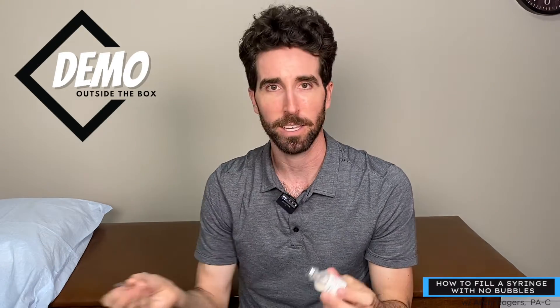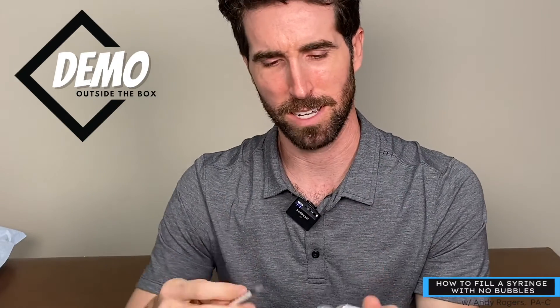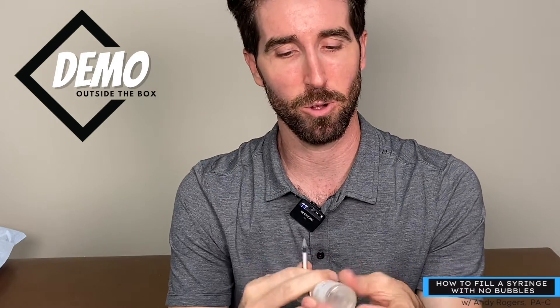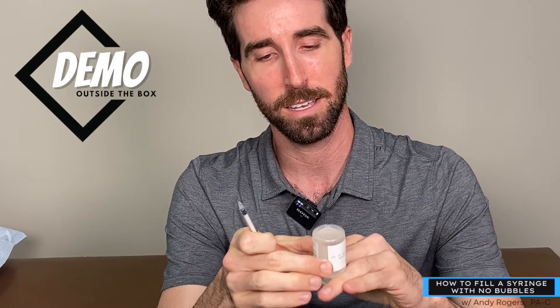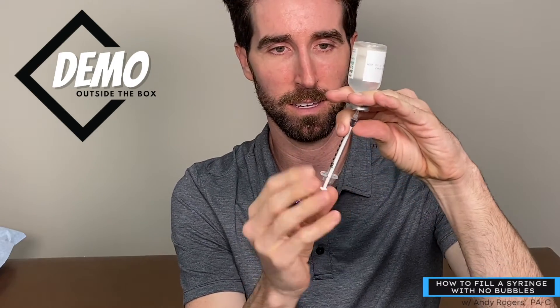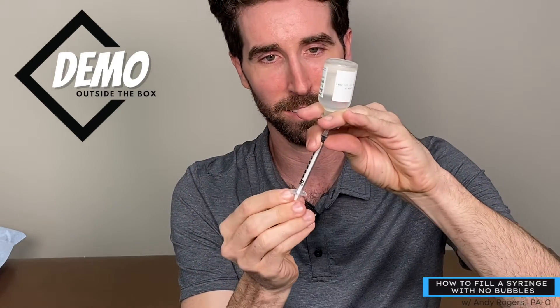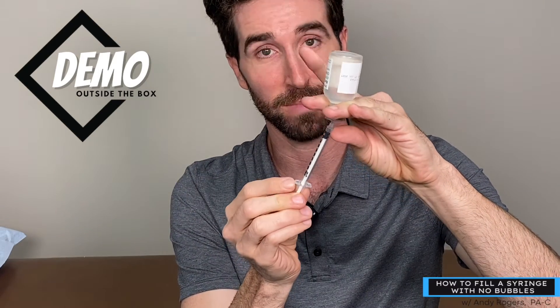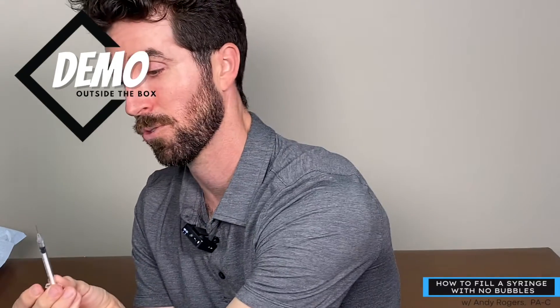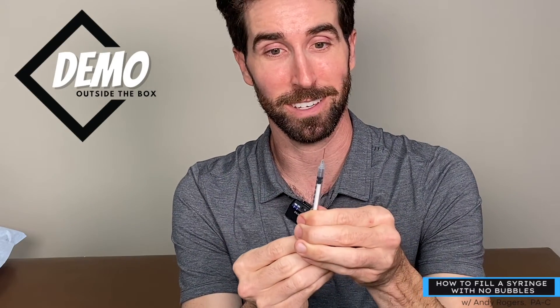They call this the alligator technique — you hold the syringe in your non-dominant hand like an alligator and draw up. This is how you keep it all in one hand so you can play around with it. That's another way of doing it. Remember: flick and push, and gently guide out.